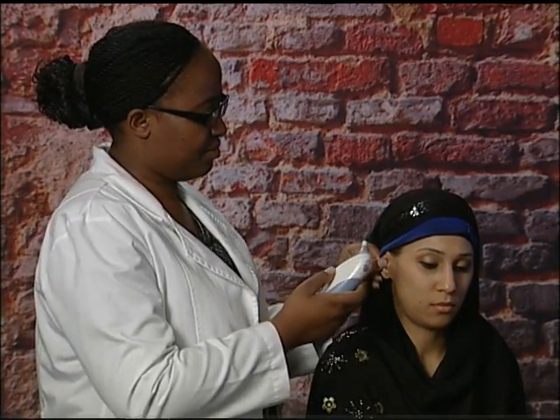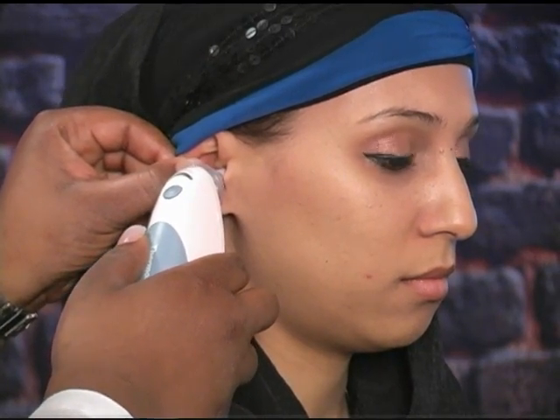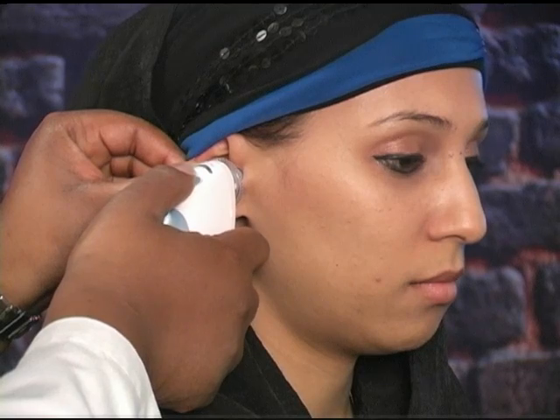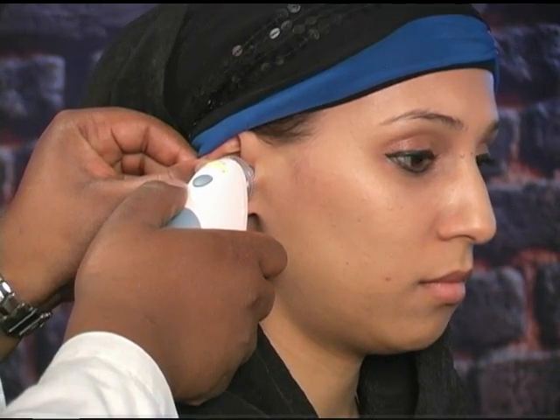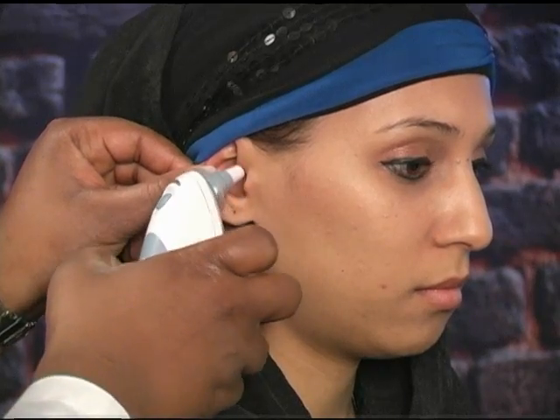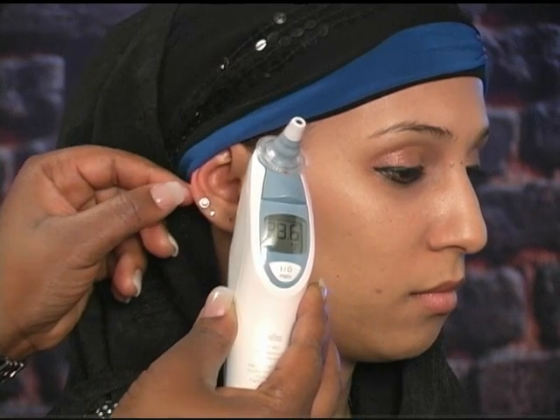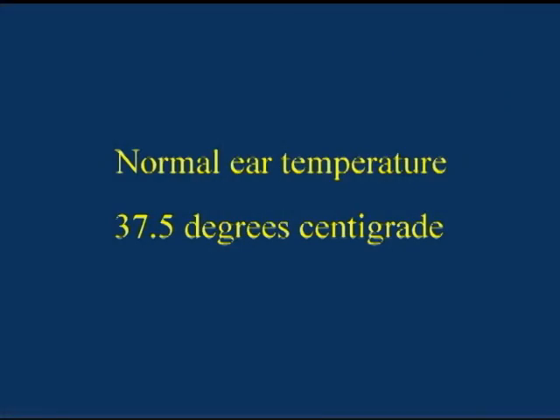When taking the ear temperature, first cover the tip of the thermometer with a disposable cover slip. Then turn the thermometer on. Then gently pull back on the ear and insert the tip of the thermometer into the ear canal, and then press the start button. Keep it until it beeps. The reading will be displayed on the thermometer.